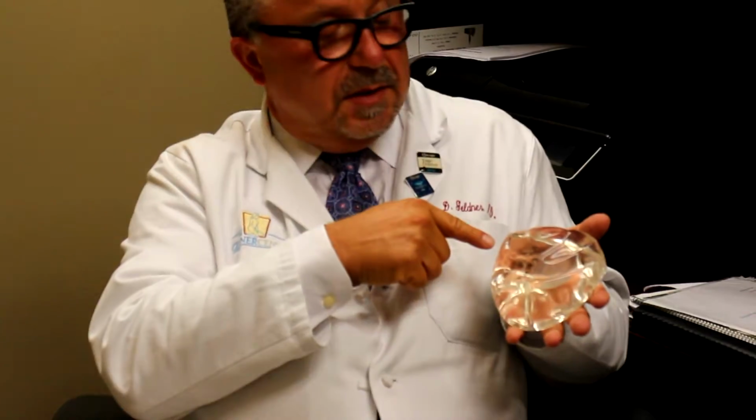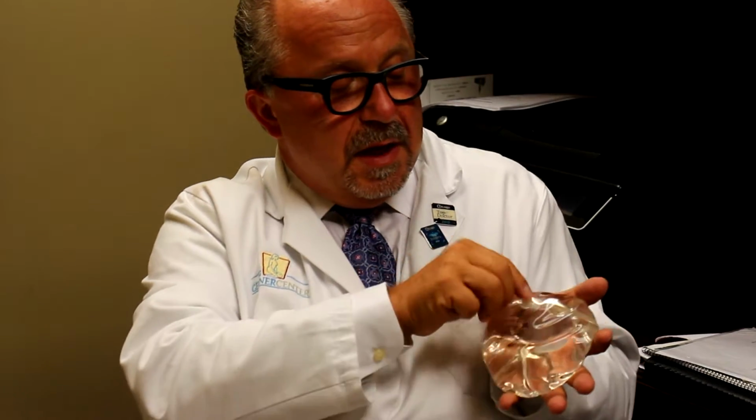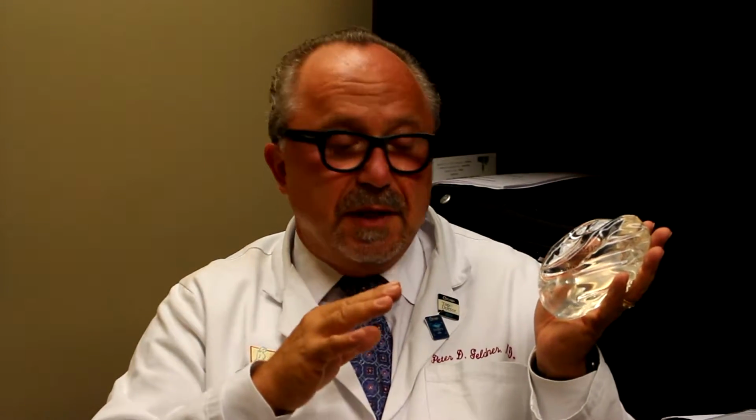What's the downside? If you hold this implant up, then you can see this, and this is wrinkling and rippling. And this is something that's inherent in any type of a smooth implant.